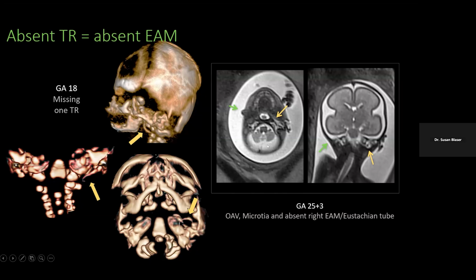So let's look at the axial view. And again, there is the pinna displaced forward, and it's a bit of a lump. Here happens to be the pinna on the other side, and that's normal. You do have a prominent cisterna magna. Here is the semicircular canals here and here, cochlea. And if you look on this side, you can see the tympanic recess and extension into the eustachian tube. On the coronal view, you can see actually the ossicles. And again, not terribly clear.